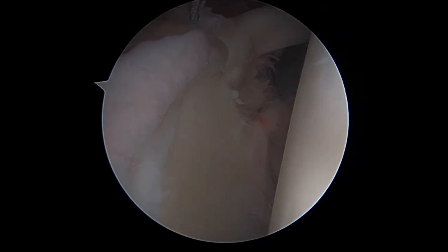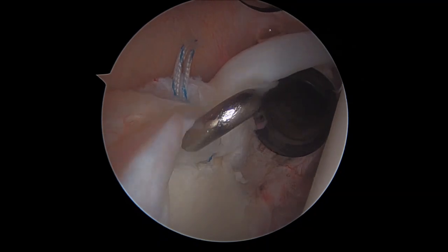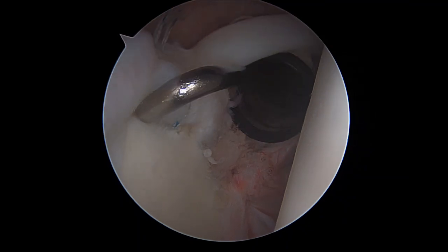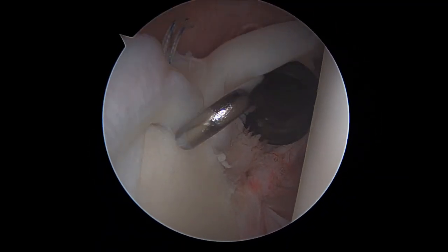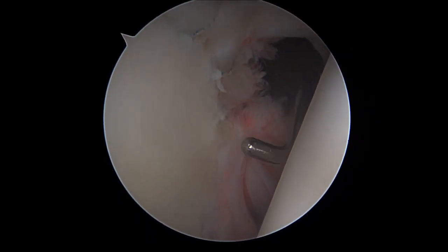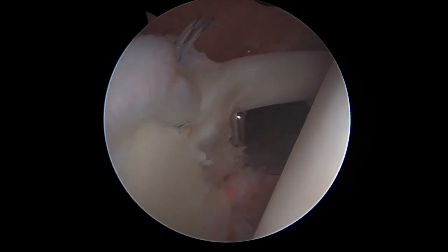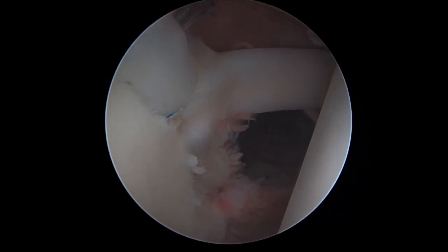This is it. We finally introduce our metallic probe to assess the final result, and it's a good result. We are happy with it because we have a very good anatomical reproduction of the insertion of the biceps anchor on the upper pole of the glenoid and a very stable labrum, both on the anterior and the posterior portions of the SLAP tear. At the same time, without over-constraining or entrapping the intra-articular portion of the biceps tendon, we are able to retract our cannula.